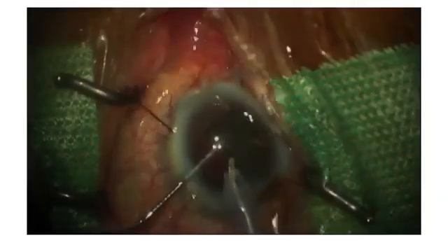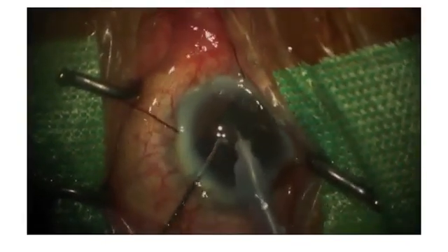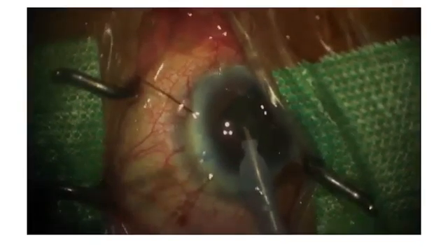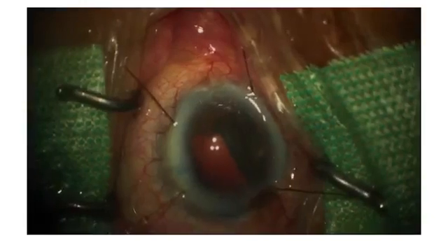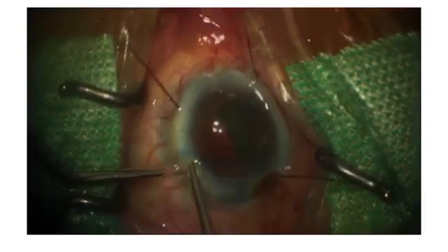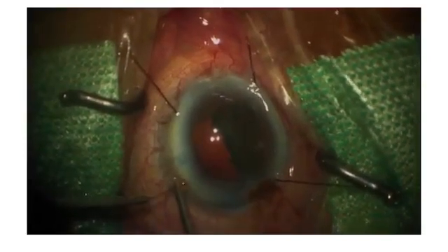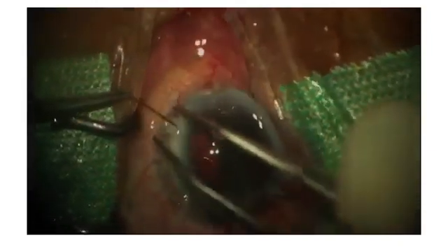This video will show how to use the iris hook, moved from the iris to hook the anterior capsule, in a case that has poor zonular support. You can use 1 hook, 2 hooks, 3 or even 4 hooks to hook the anterior capsule, and after that you remove the remaining lens in the eye and avoid touching the area that you hooked with the capsular hook. Remember, the iris hook is hooked only in the anterior part of the lens.